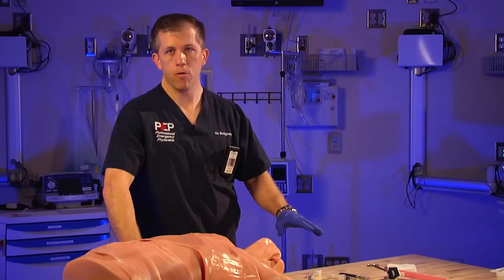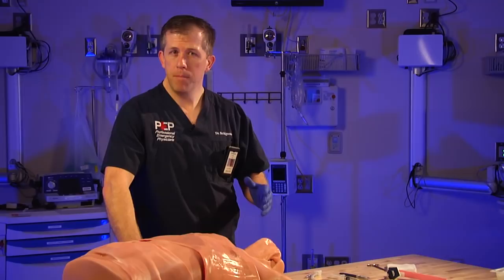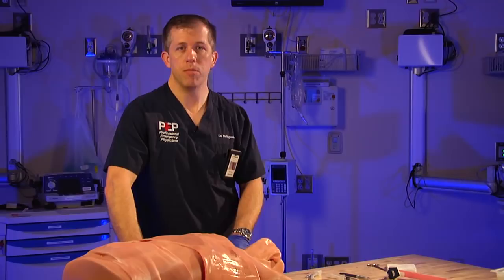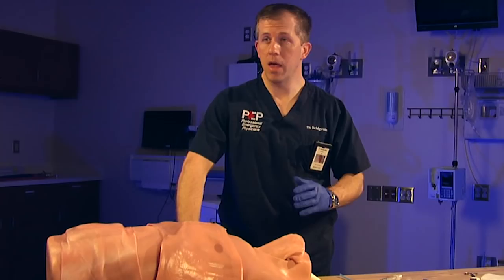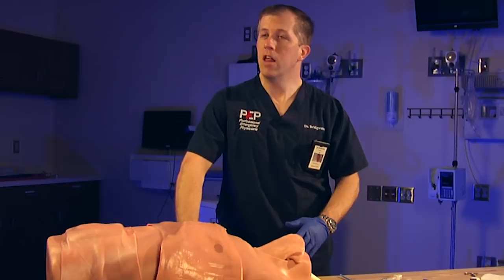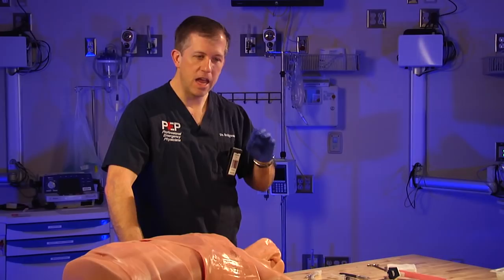Think about this procedure long before you need it. If you've got a difficult airway or you're predicting one, be prepared. Get everything out, know where your landmarks are, mark them, and have everything ready so you're not hustling at the last minute. These are always stressful situations with critical patients who have very unstable vital signs, and those few extra seconds can mean the difference between life and death.